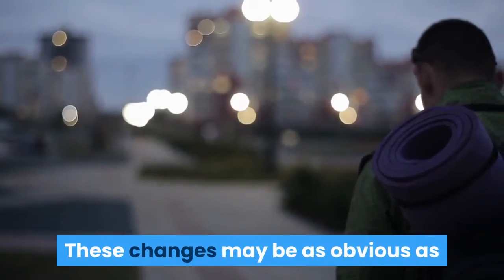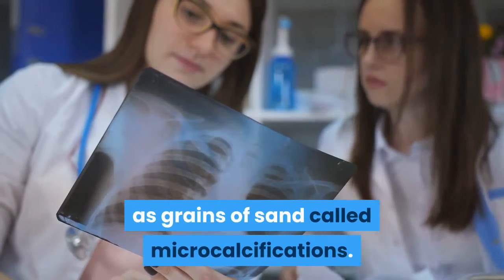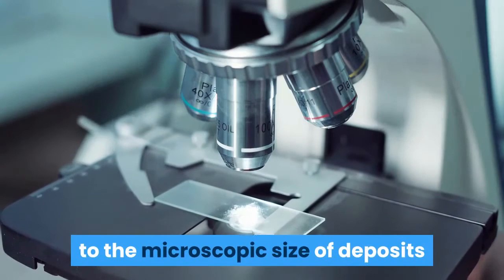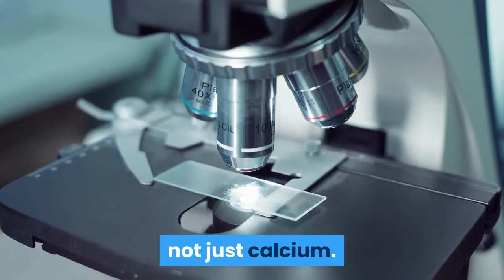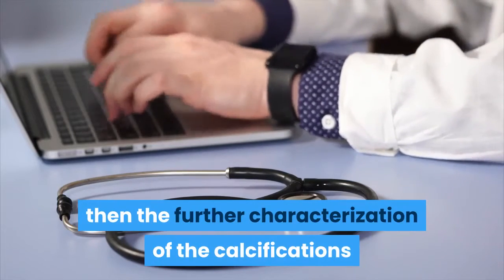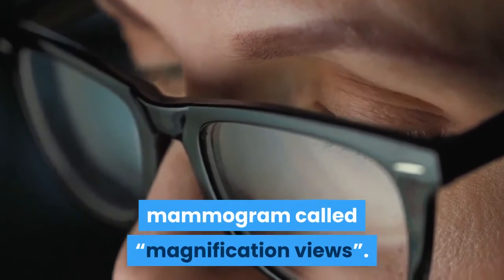These changes may be as obvious as a mass or as subtle as tiny white spots as small as grains of sand called microcalcifications. The term microcalcifications refers to the microscopic size of deposits that are actually composed of many kinds of minerals, not just calcium. If this finding is noted on a screening mammogram, then further characterization of the calcifications is usually needed with a special diagnostic mammogram called magnification views.